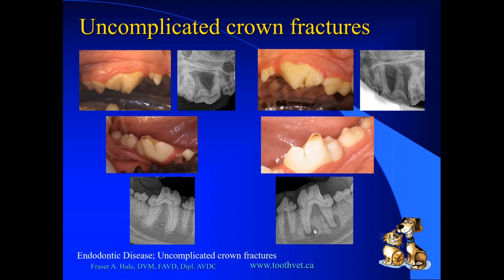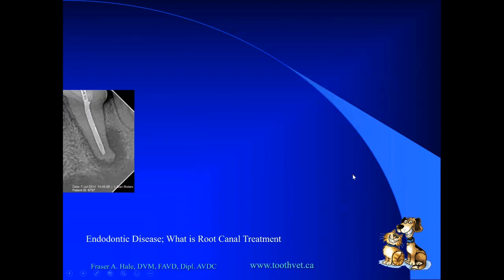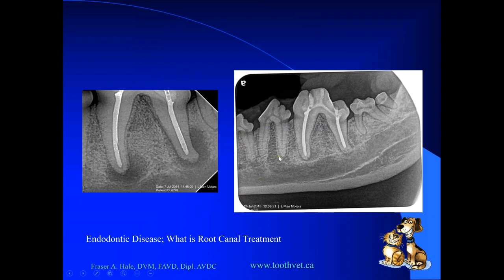So this is a tooth that's dead and requires either root canal treatment or extraction. And because it's a big important tooth, and taking that out would have created a large wound that would have been challenging to get to heal, root canal treatment was deemed the preferred treatment, so that's what was done. There is a paper on what is root canal treatment. Here's the tooth immediately following root canal treatment in July of 2014, and here we have follow-up radiographs a year later showing nice resolution of those apical granulomas. And there's another value for radiographs: monitoring response to treatment. Did things get better, stay the same, or get worse? And in this instance, I'm happy to say things got considerably better with the treatment.